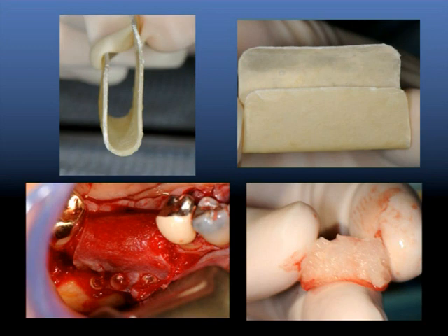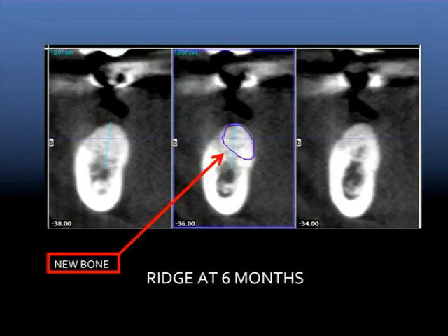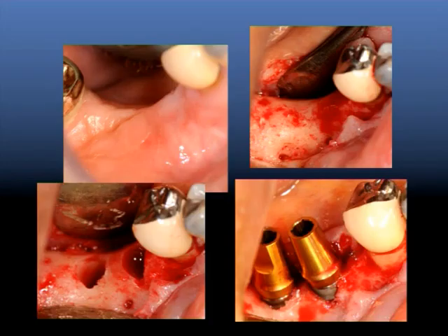We can see that here we've used the collagen construct with resorbable screws and with BMP, and we have done a ridge rebuild on this. And we can look at the end of the 6 months and see the amount of bone that we've generated with this approach and more or less double the size of that ridge. But the question is then you place implants into it, what kind of stability you're going to have, and of course you don't want failure.